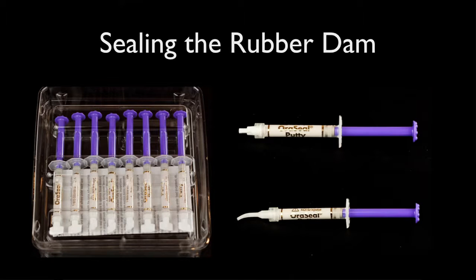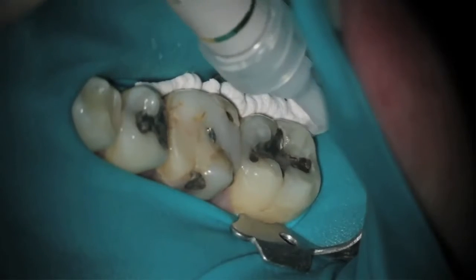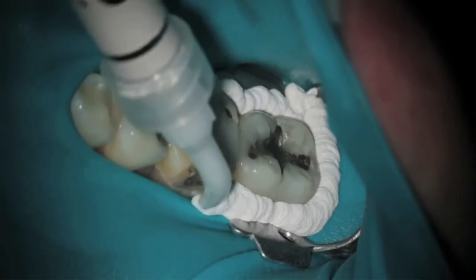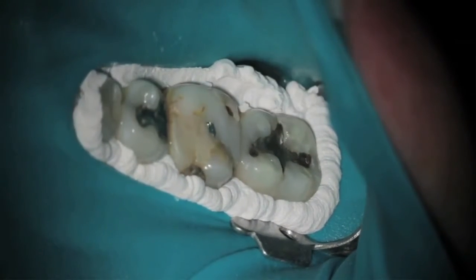But we also have to consider sealing off those parts of the rubber dam with a sealing agent. For that I use a product called Oraseal, sold by Ultradent. It comes in a putty form. I like the putty form, it's not as thick, but they also have the caulking agent as well. So what we do here, after we have split dam, and again, I love split dams because I love seeing multiple teeth in my area of access, it helps me stay on track with the pulp chamber, and this is live. We just squeeze it all around the tooth, and this helps me seal it. That way I don't have to punch an individual hole for each tooth. It's a very easy way to do it.